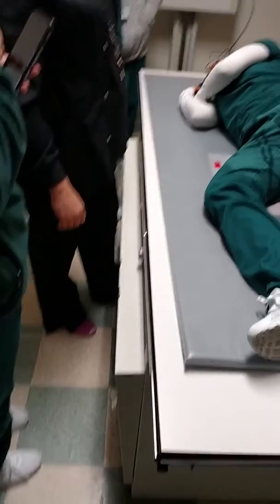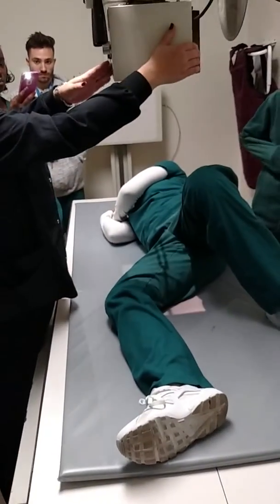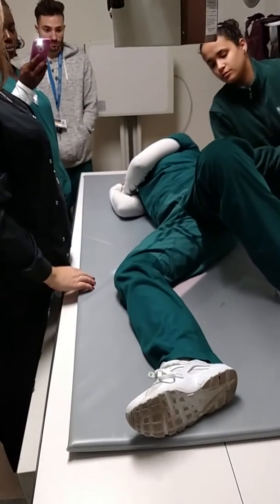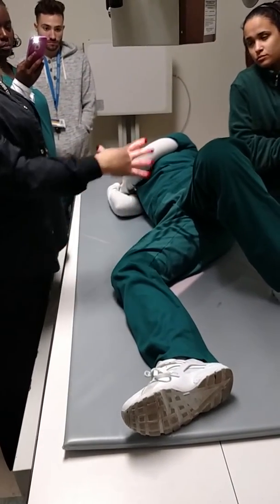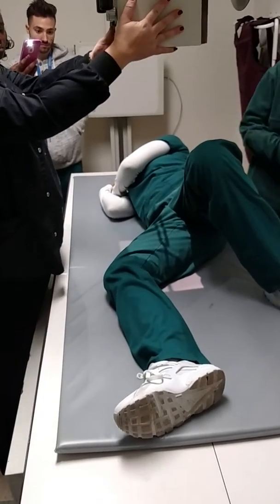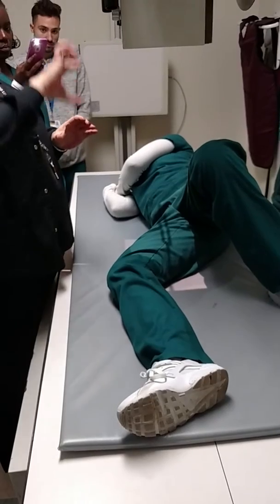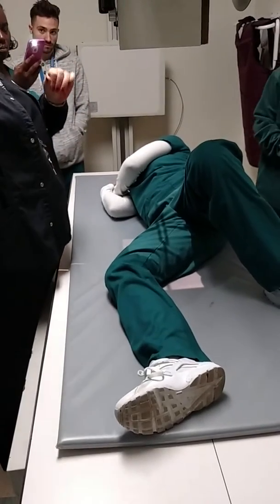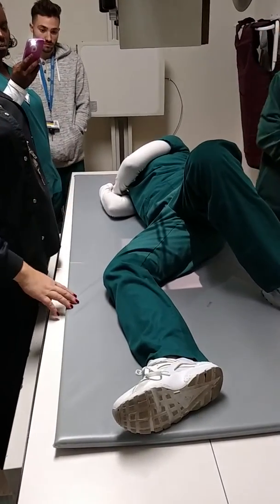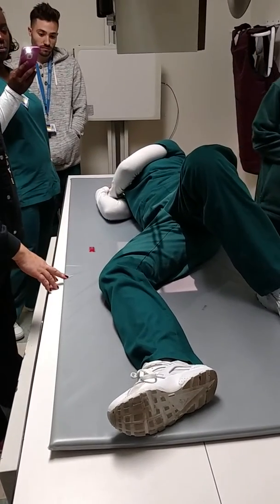It does look weird, but back in the old day, when it wasn't digital, we could do this. Now, doesn't that make more sense? Doesn't that look pretty? We can't do that anymore because you can't cock on a digital. So now it's just going to look kind of funny, but the radiologist knows that's what we do now. You're going to have one with the bottom going this way, and then one with the top going that way, kind of corner to corner on the picture. All right, that is a femur.